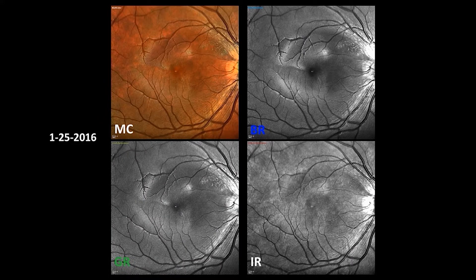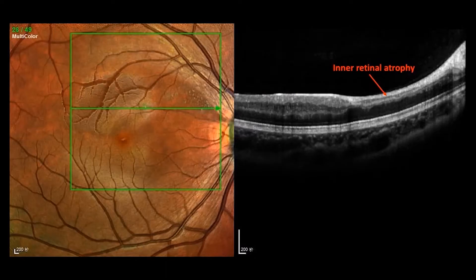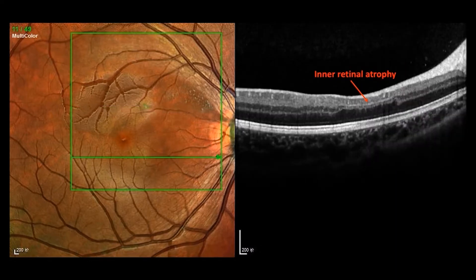After four months, inner retinal edema disappeared. But we noticed inner retinal atrophy in the ischemic area on OCT, especially on the inner nuclear layer.